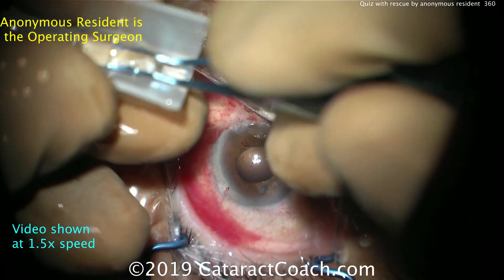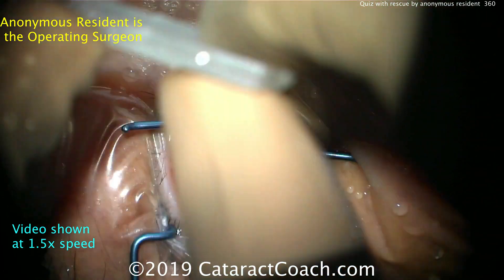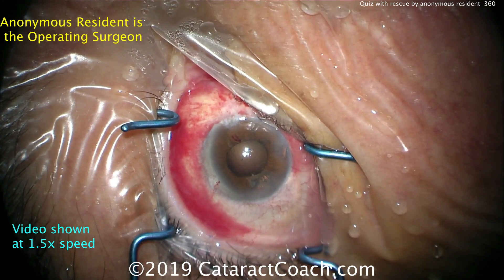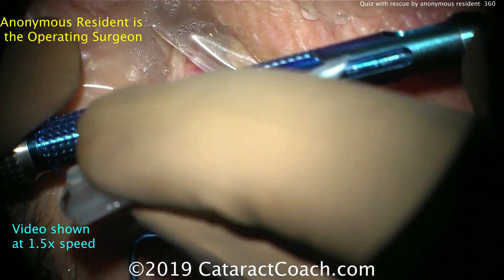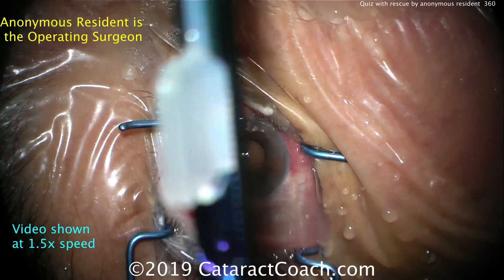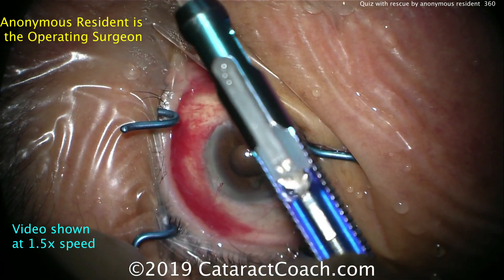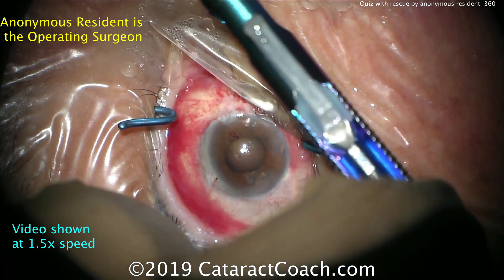This is a video sent in by an anonymous resident, and what I was most impressed with is that the resident figures out that there's a problem and then saves the case — and that's important. Here's the lens going into the injector. The lens looks great: appropriate power, appropriate type of lens. A three-piece lens is good for the sulcus.